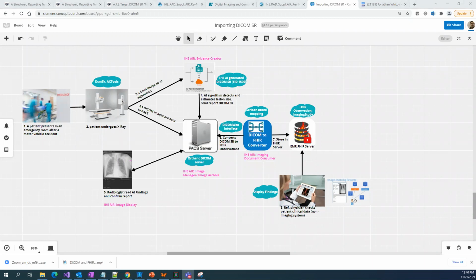Sorry, the pull, Vinu. Is the pull happening in the IHE profile, or is it SR? No, the IHE profile is just a definition of how it is done. The pull is basically our DICOMweb interface, the REST calls which we are going to make to this PACS VNA. That is what is our DICOMweb interface, and all of these things are defined in the IHE profile.